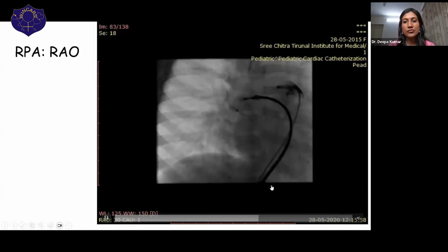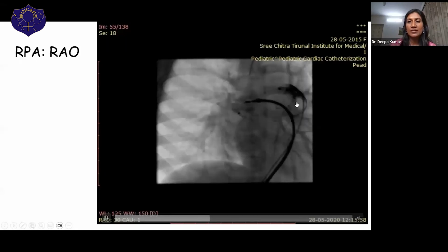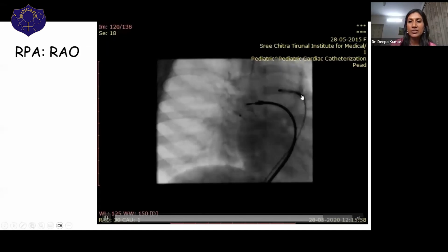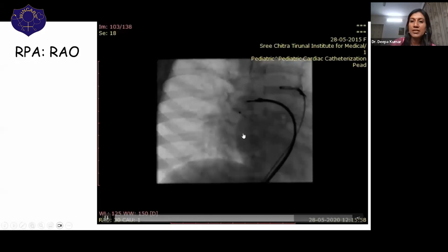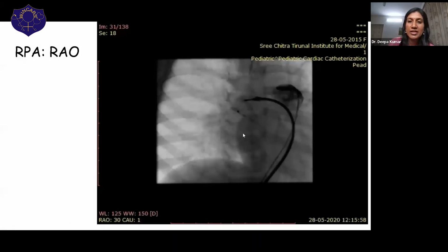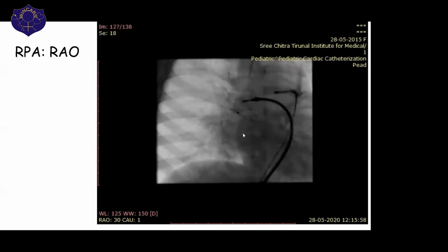We have passed the catheter from the femoral vein, IVC, right atrium, right ventricle to the RPA, and we are taking another check angiogram with a pigtail. And what are we seeing here? Something has been closed. Some communication from the right pulmonary artery has been closed. So any guesses to what it is? Non-committal answer. Fistula. Fistula, someone has written.